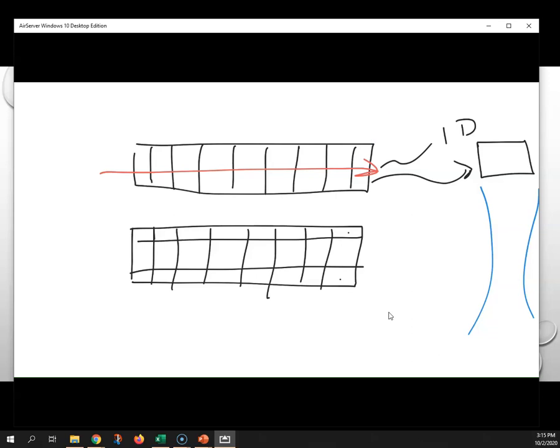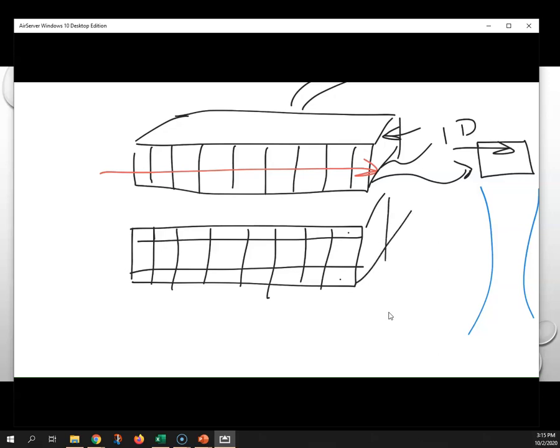Now, this one, if you look at it from the side, I'll just redraw the sides here so that when I'm talking about the side, here's a little probe. You've got your cord coming into the back of it here, and so this is the side, and if we look at that side, this is what we see on the one-dimensional. On the two-dimensional, or the 1.5 dimensional array probe, when we look at it from the side, what we see is a transducer that has these cuts in it like this. So it's actually a linear array transducer in the side too.